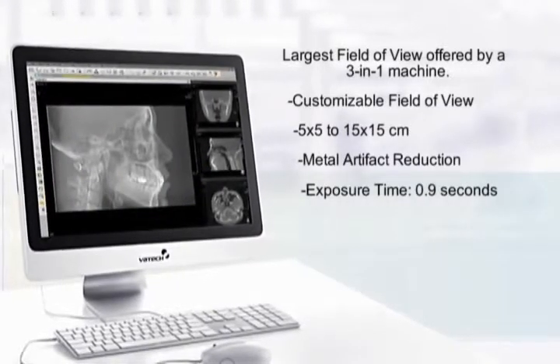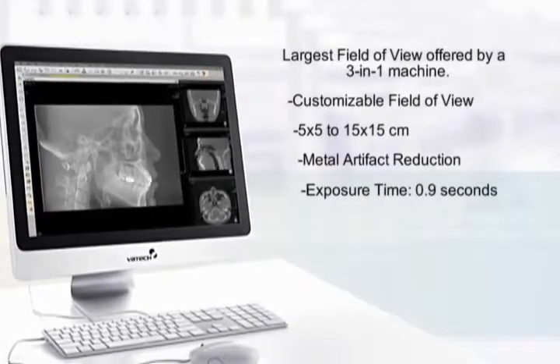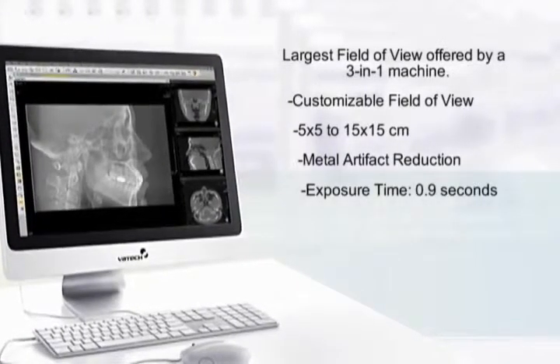Metal Artifact Removal Technology, or MAR, automatically removes artifacts caused by metal objects, significantly improving the image quality.